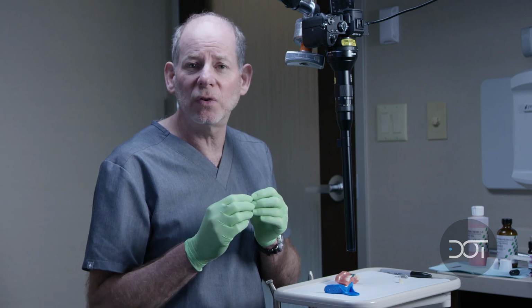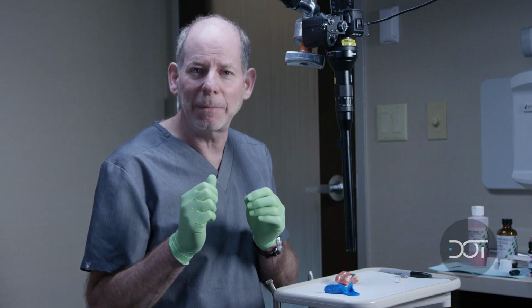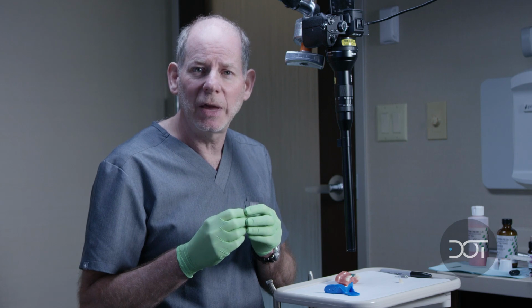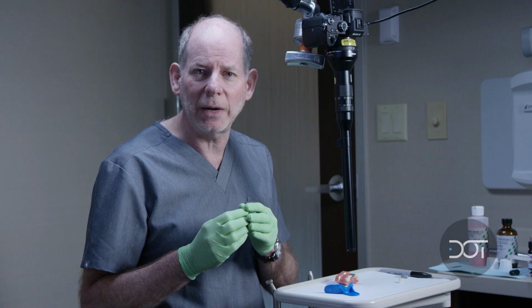I like the fact of the implant impression coping being more stable in this impression versus a closed tray technique where you have to remove the coping from the implant after the impression and then pop it back into the impression. I'm always nervous that with the closed tray technique, that impression pin is not going to be absolutely positively seated. So I prefer an open tray technique if possible. Also, there's the opportunity for doing a digital scan of your implants, and you'll find that information on other mini tips. So today for the open tray, let's move forward.